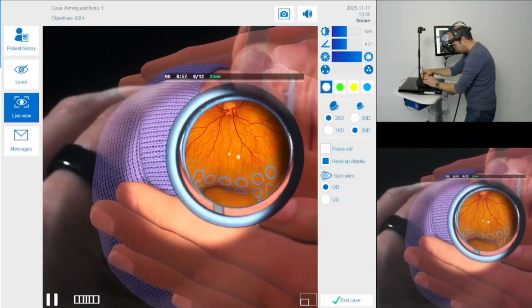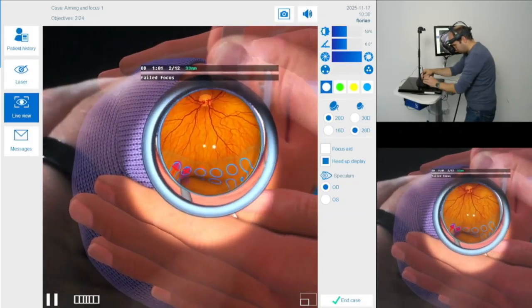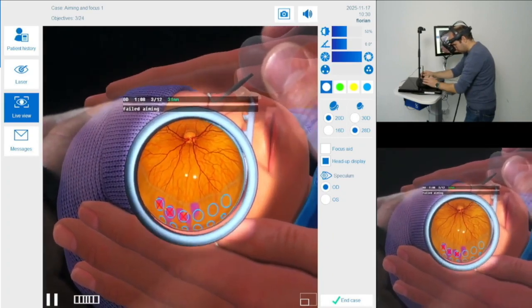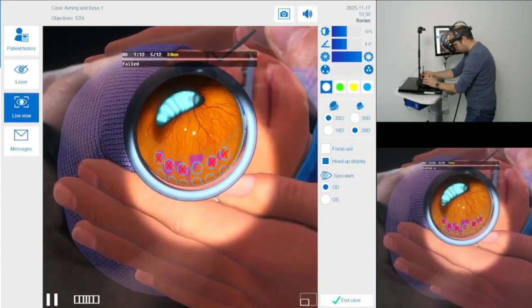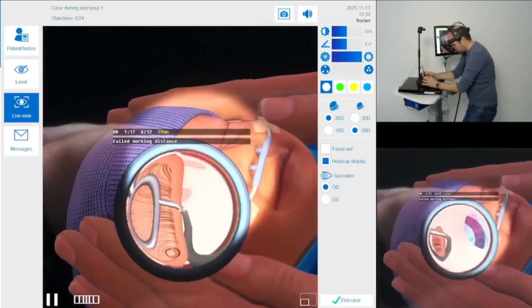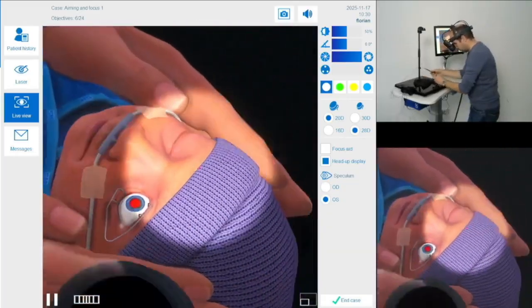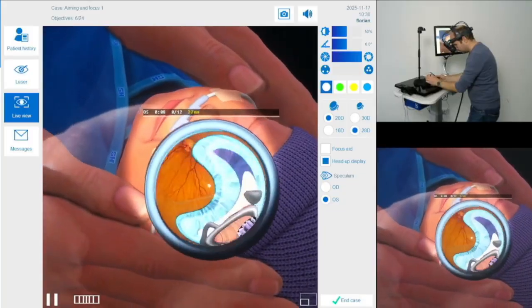Here for me in the video it's hard to see the aiming beam, but on the simulator I had a quite good look. And you see, it shoots every second and I'm not capable of doing that. You have to do everything correct, the working distance, the focus, so your distance between the head and the patient, and then every 1 second you have one shot and you need to position it correctly.